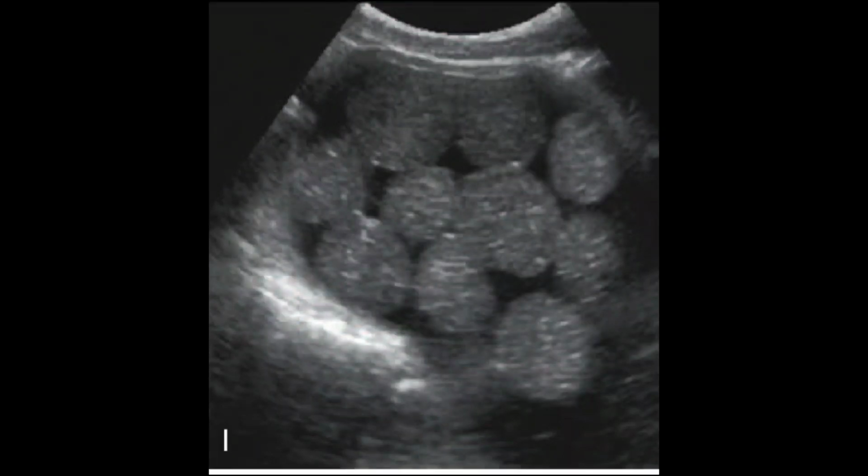But in all these forms, they are different from one another, and it needs attention. Some of the lesions you may be able to pick up on the transabdominal scan, while some may need transvaginal.